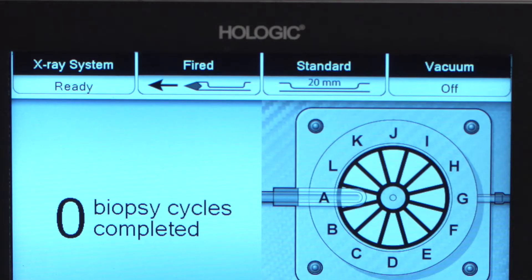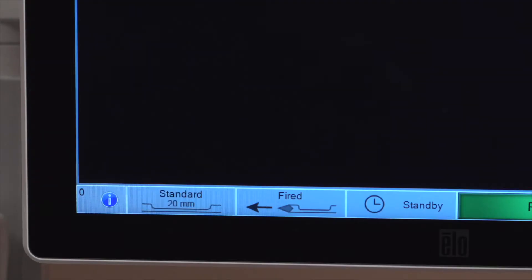The technologist will check that the system has recognized the correct aperture, either 12mm or 20mm, in the taskbar on both the technologist and imaging displays.